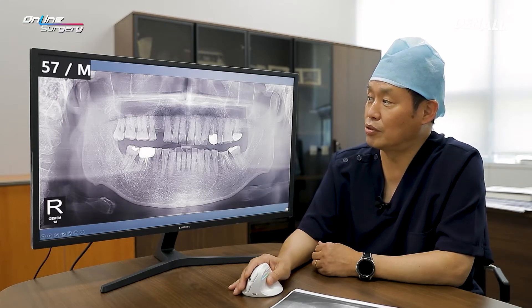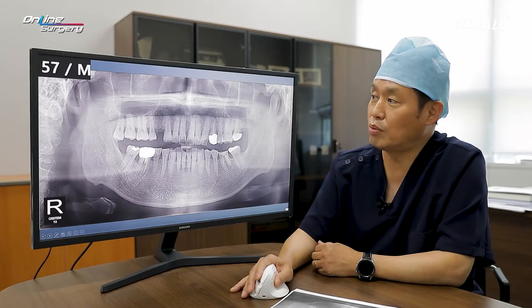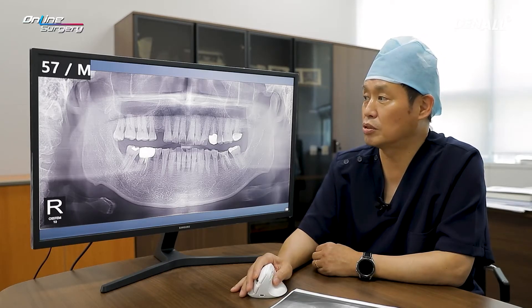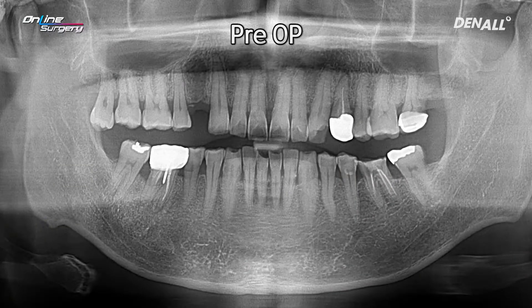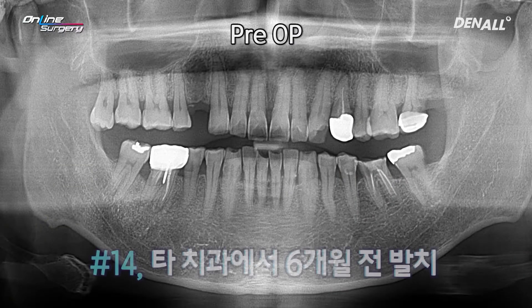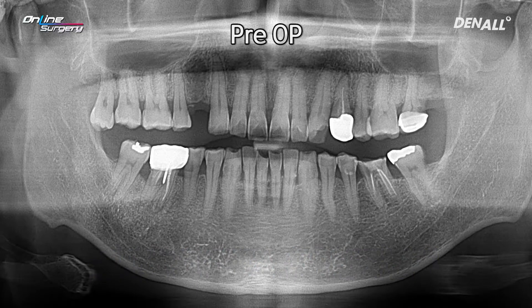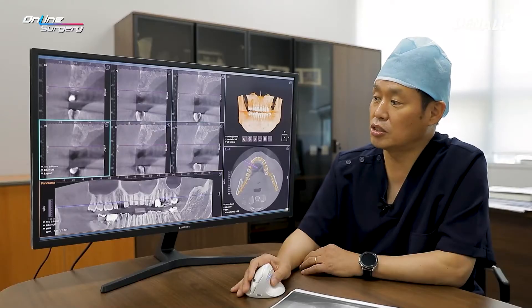57-year-old male patient — if you look over here, number 14 is missing. There is no special medical history. It has been approximately 6 months since number 14 was extracted. Extraction was done in a separate dental clinic and the patient came in for implant treatment. I took a CT.